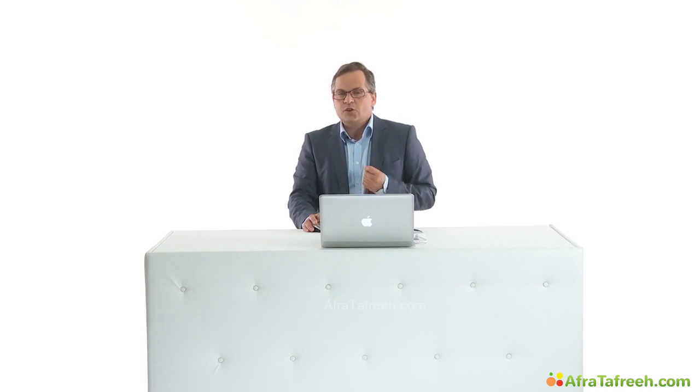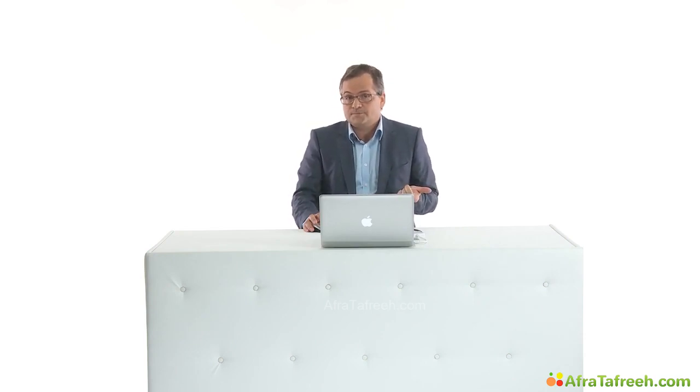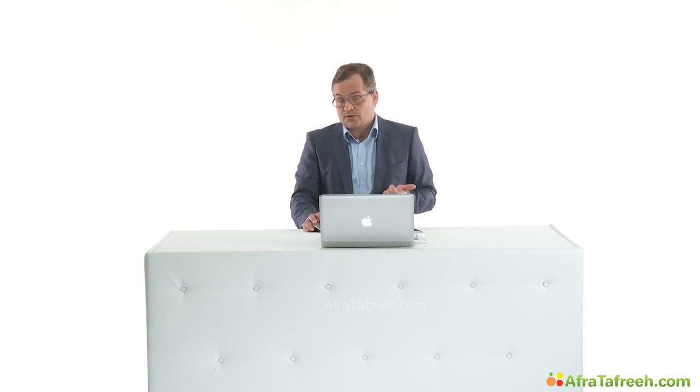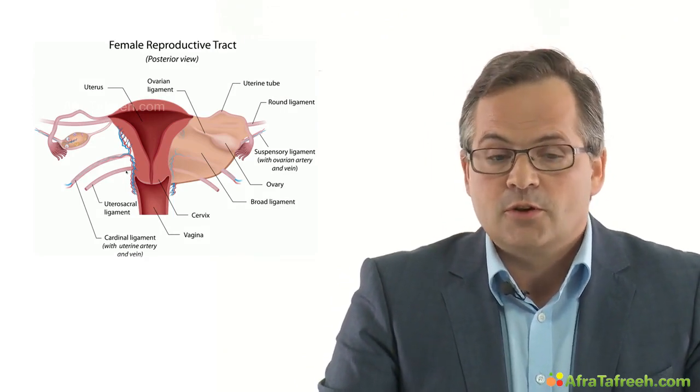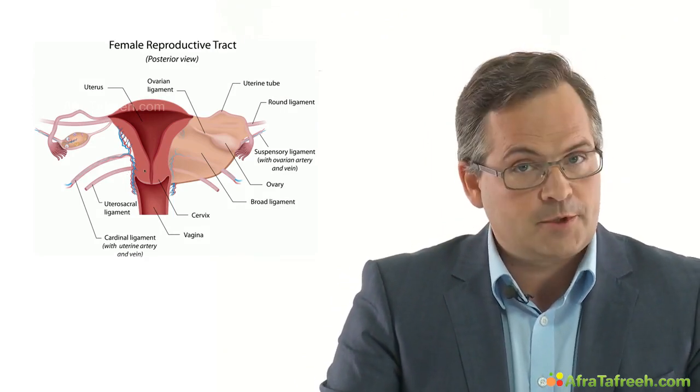If the uterus cannot be detected or is extremely small, this may be for the following reasons: older age of the patient, or a very young patient, or, very rarely, an inherited malformation syndrome. Using this picture, we can repeat the anatomy of the female lower abdomen.